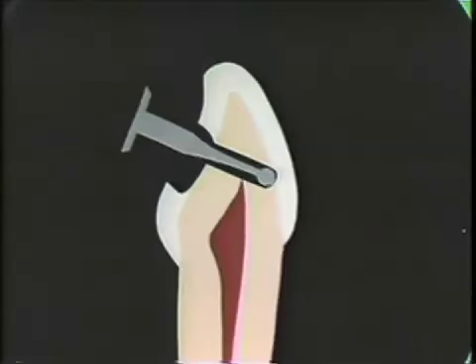Now, this person's having problems trying to reach the pulp. Is his problem an improper angulation of his handpiece, or is his problem a malpositioned, malaligned tooth? You should recognize that his problem was not aligning the handpiece in the long axis of the tooth. He kept his handpiece in the same angulation as when he penetrated through the enamel and missed the pulp.